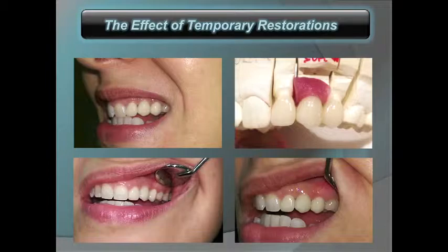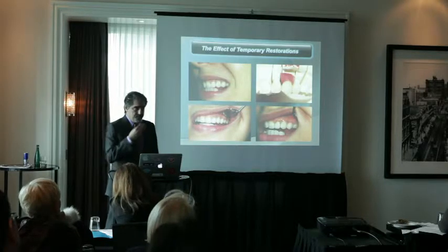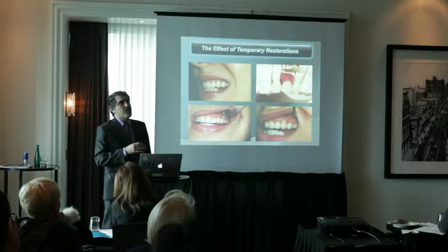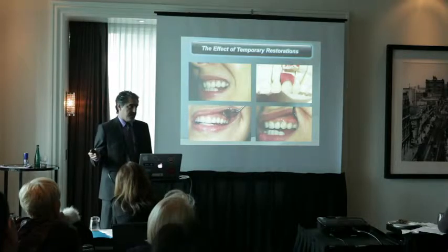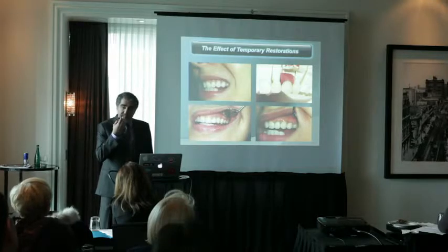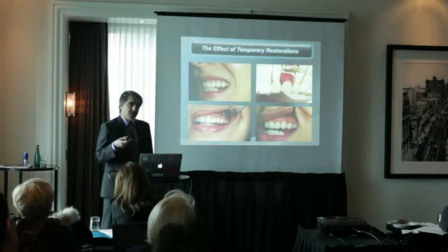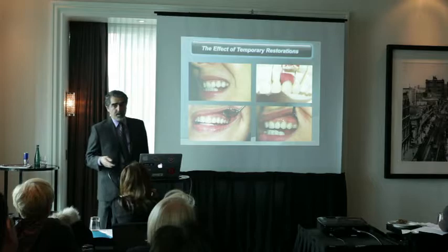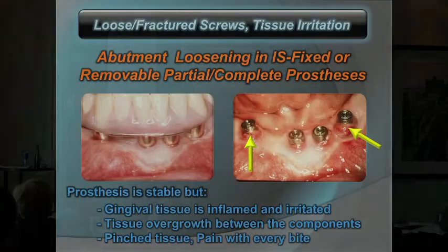You develop the emergence profile that you want, and then you capture that emergence profile, you register that emergence profile for your technician, and now your technician can develop a nice prosthesis for you, and you can avoid the prosthetic complications and aesthetic complications that we may face if we don't do that. Okay, let's move on.